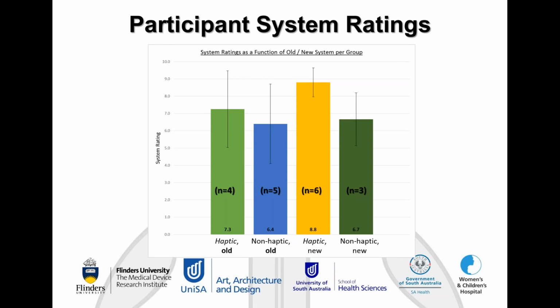Just to add again that there is no statistically significant difference between these results. So statistically, it's not a statistically significant result, but you can see where the trend is going in terms of how we might develop and progress the gaming system into the future, knowing that the haptic system is rated higher and the fact that if you earn the games, you tend to play it for longer.